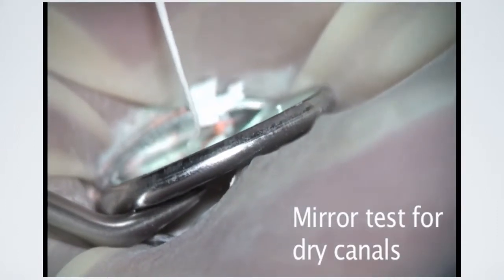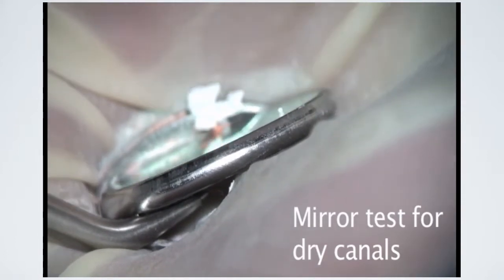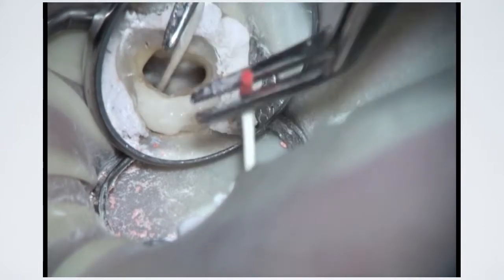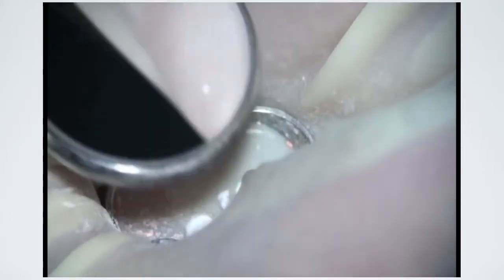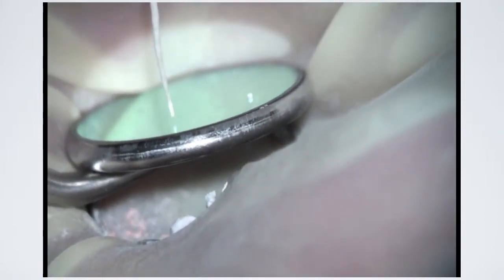If the paper point bends when tapped against the mirror, the canal is not dry. A dry canal is indicated only when the paper point is removed from the canal and remains stiff after tapping against the mirror. The mirror test is a predictable way to determine that the canal is free of fluid and ready to obturate.